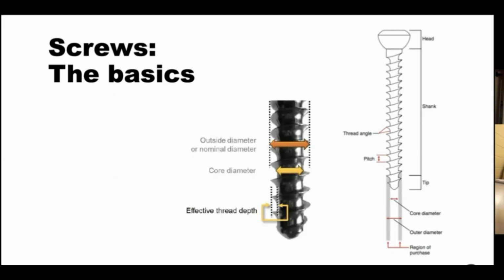Learn how the different screwdrivers interact with the different screws, and how the screws interact with different types of plates. Then observe the attendings and experts you're working with use these in the body and start to understand the pros and cons and when it is most appropriate to use one or the other. This is really how you progress. But let's just start with the basics.